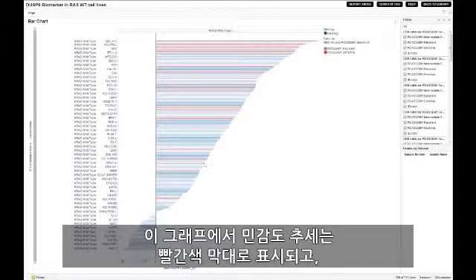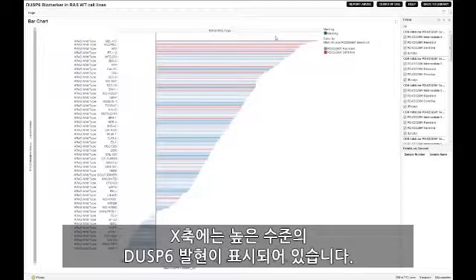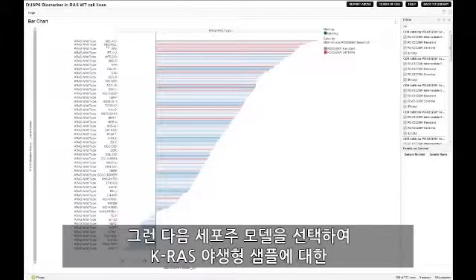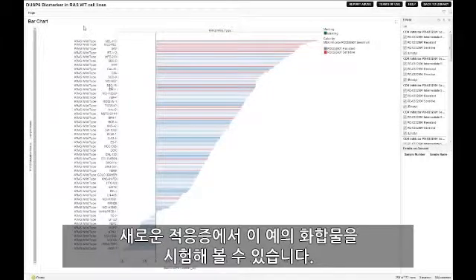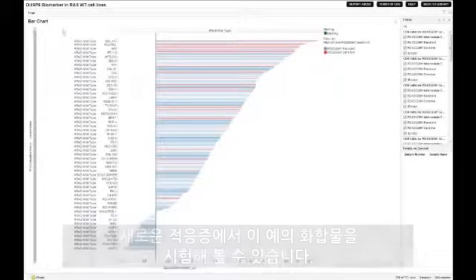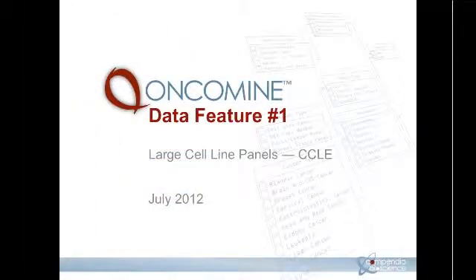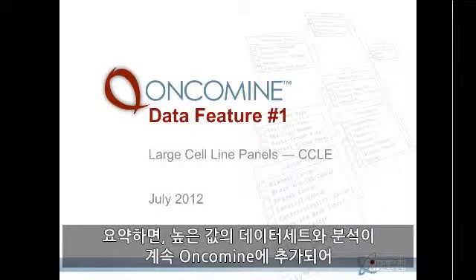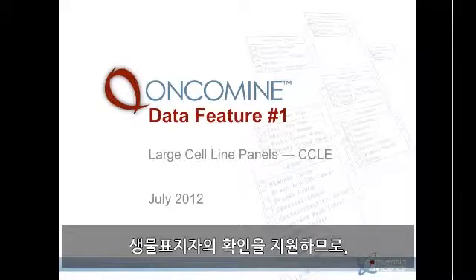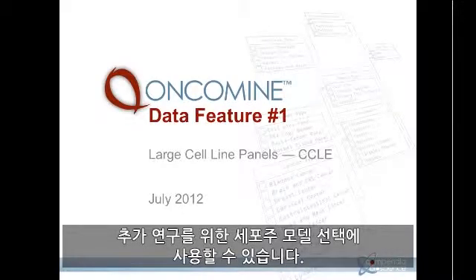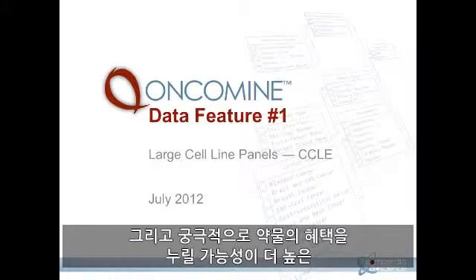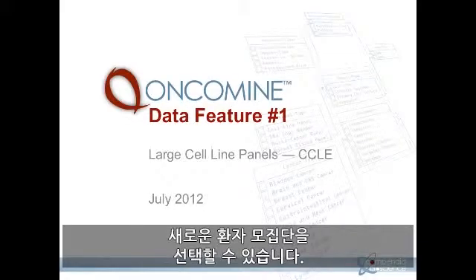From this plot, we see the trend of sensitivity indicated by the red bars and high expression of DUSP6 as indicated on the X-axis. We can then select our cell line models to test our compound in the new indication of KRAS wild-type status samples. In summary, high-value datasets and analyses continue to be added to Oncomine to drive the identification of biomarkers that can be used to select cell line models for further investigation, and ultimately to select new patient populations that are more likely to benefit from the drug.